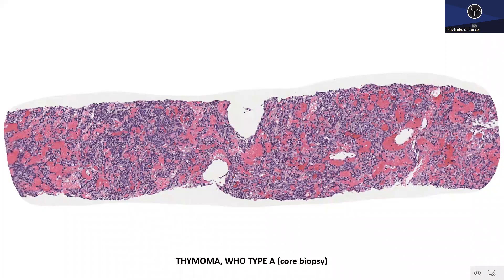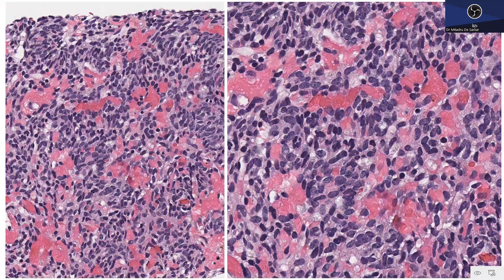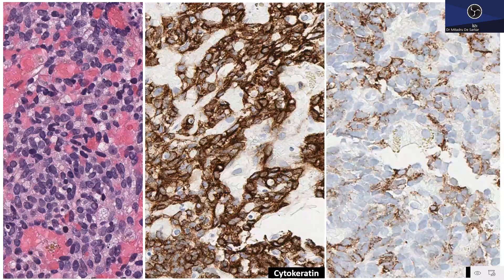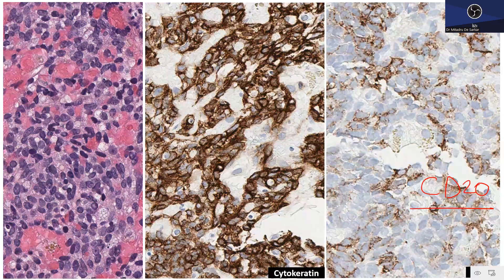On core biopsy of type A thymoma, ovoid to slightly spindle cells with intervening hemorrhage are seen. IHC shows these cells expressing cytokeratin and importantly CD20. Although CD20 is a B-cell marker, in type A thymomas it is aberrantly expressed by the epithelial cells. To summarize type A thymomas: they are lymphocyte poor, epithelium rich, with spindle mesenchymal-like morphology that stains with epithelial markers and aberrantly with CD20, and are negative for CD5 and CD117.